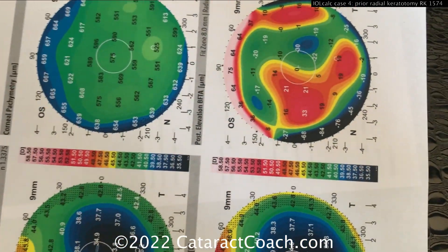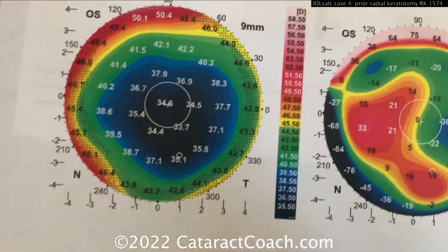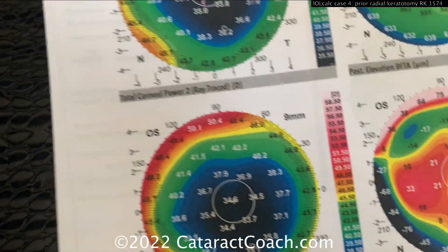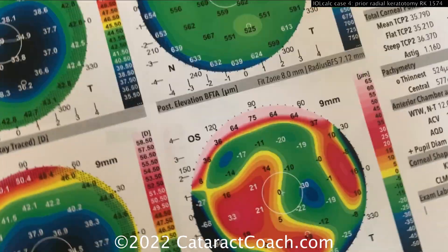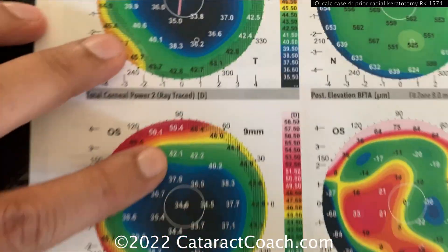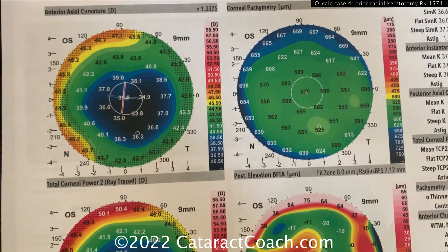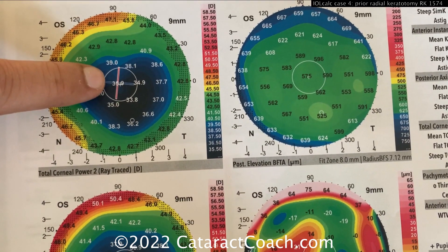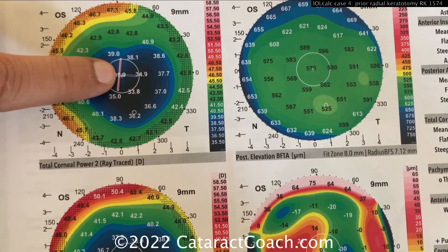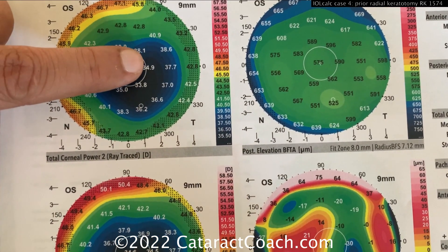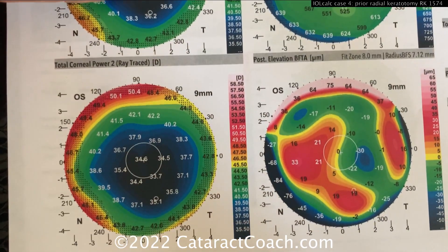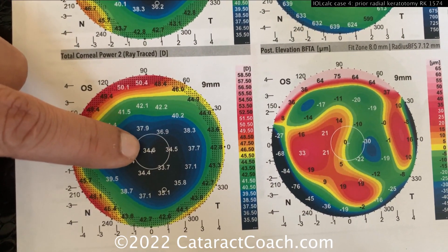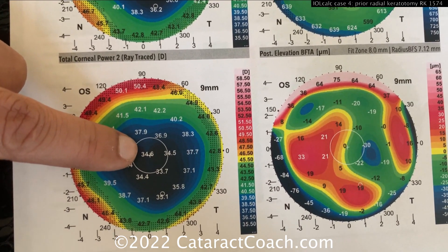Moving on to the left eye tomography: the curvature is very flat here — 35 diopters centrally, 34.9, 33.8. The total corneal power ray trace comes in at about the 34.6 range.